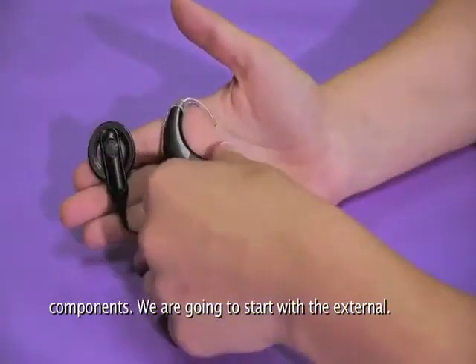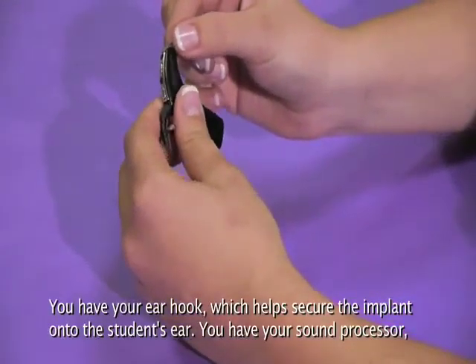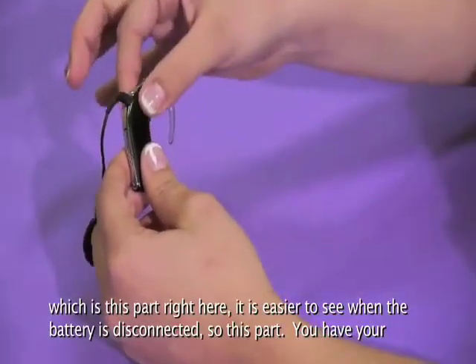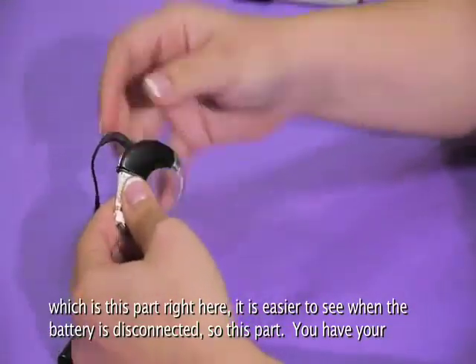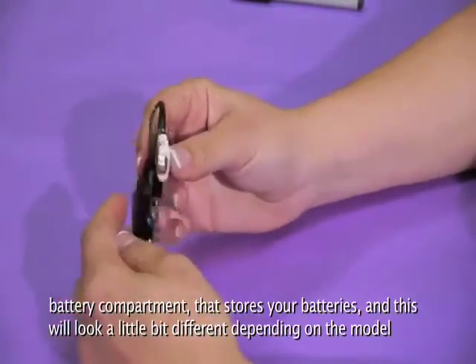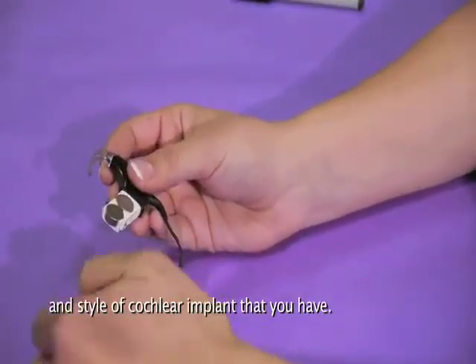We're going to start with the external. You have your ear hook, which helps secure the implant onto the student's ear. You have your sound processor, which is this part right here. It's easier to see when the battery is disconnected. You have your battery compartment that stores your batteries, and this will look a little bit different depending on the model and style of cochlear implant that you have.